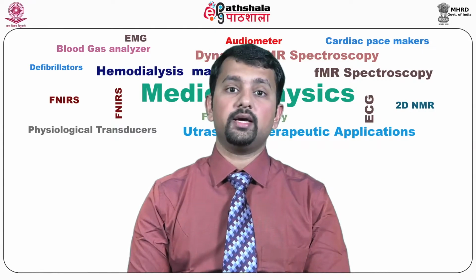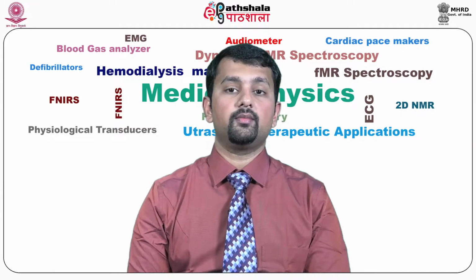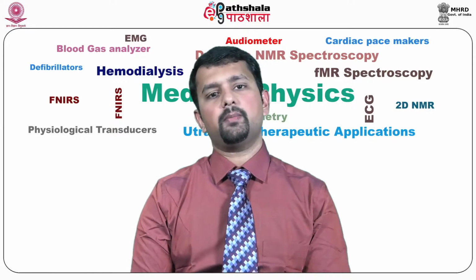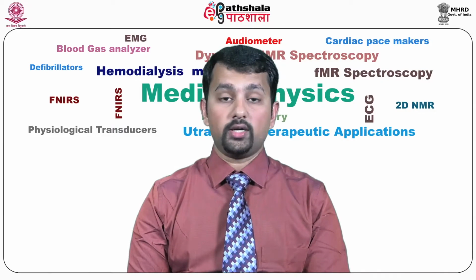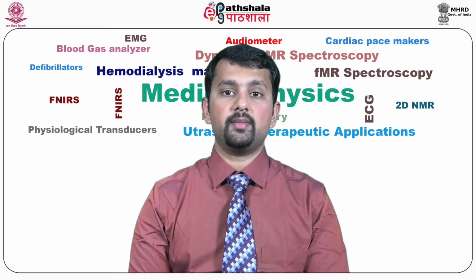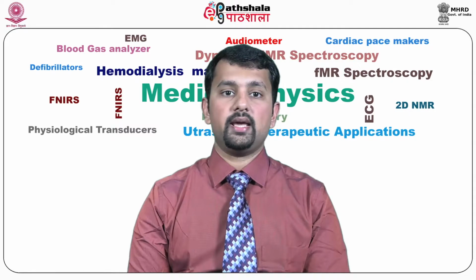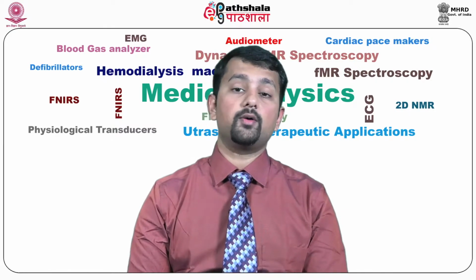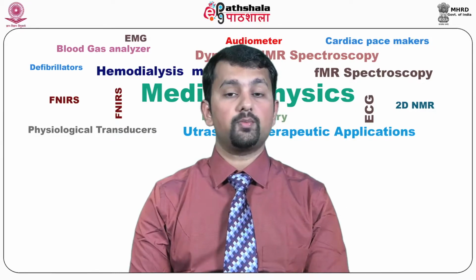Multi-voxel maps can further help localizing the site for biopsy from infiltrative brain lesions. MRS also helps with prognostication and treatment planning in oncology patients when surgery is not indicated, like in case of diffuse brainstem gliomas and intramedullary tumors in spinal cord. A choline NAA peak amplitude ratio of at least 2.1 was found prognostic of unfavorable outcome in pediatric diffuse pontine gliomas.